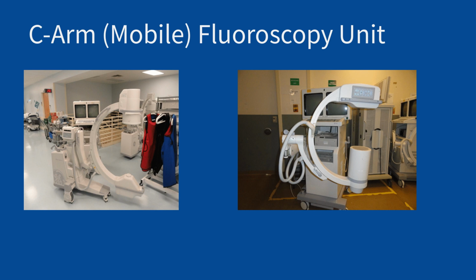You can actually see on this smaller device here, there is something called a cone, which is installed by the manufacturer. It gives us a minimum distance from the X-ray tube. So you should never remove those X-ray cones. You may be wondering, why isn't there such a cone on the larger unit? Just because of the way the unit is designed, it's a larger unit. The cone is actually built into that inferior aspect of the C-arm.